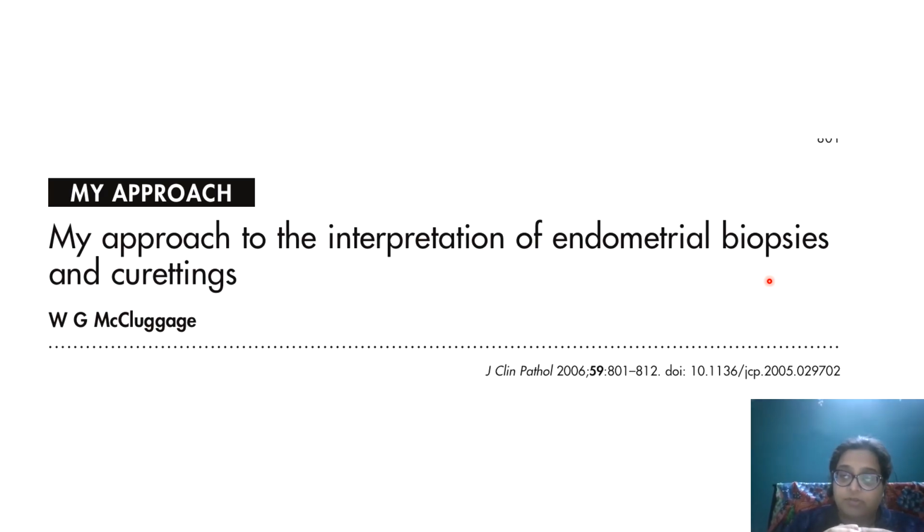They are not the pathologists. They don't know what is confusing you. Always look for viral inclusions, IUD changes. These are very, very common things that you find in women. Do not call something endometritis unless you see a plasma cell. If you get a granuloma, of course, things are different. Looking at a polyp, do not label anything as endometritis.